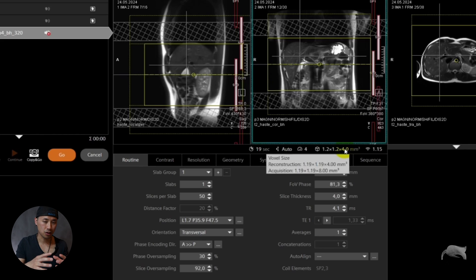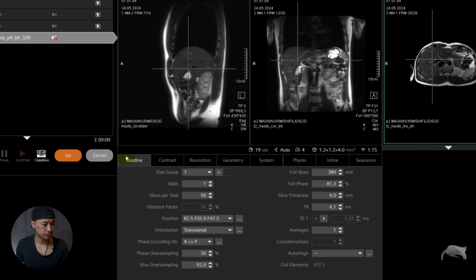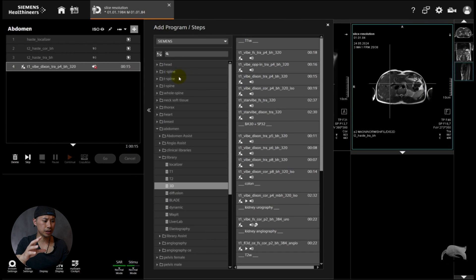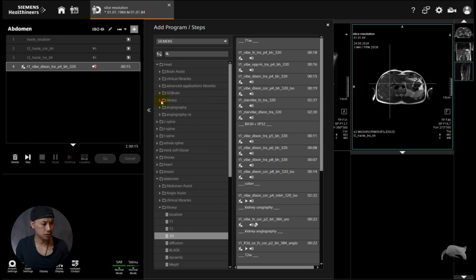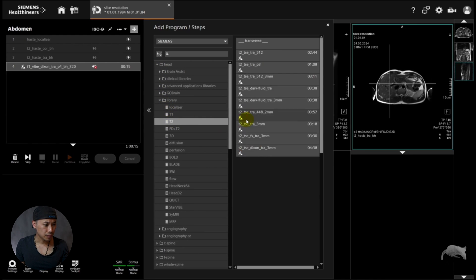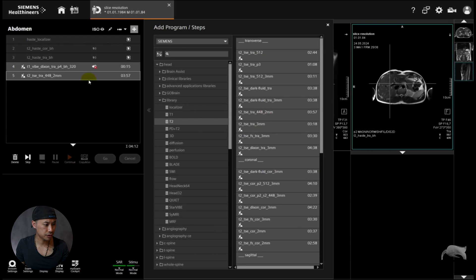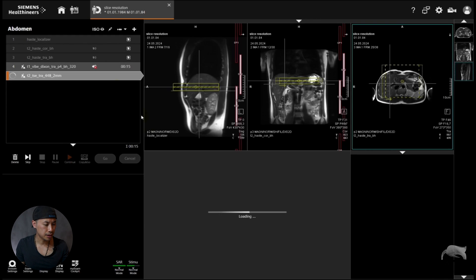All right, so let's go for 2D, just want to show you the differences on a 2D. So let's go to head, let's go to a T2, and let's just take a transversal T2 and check that out.